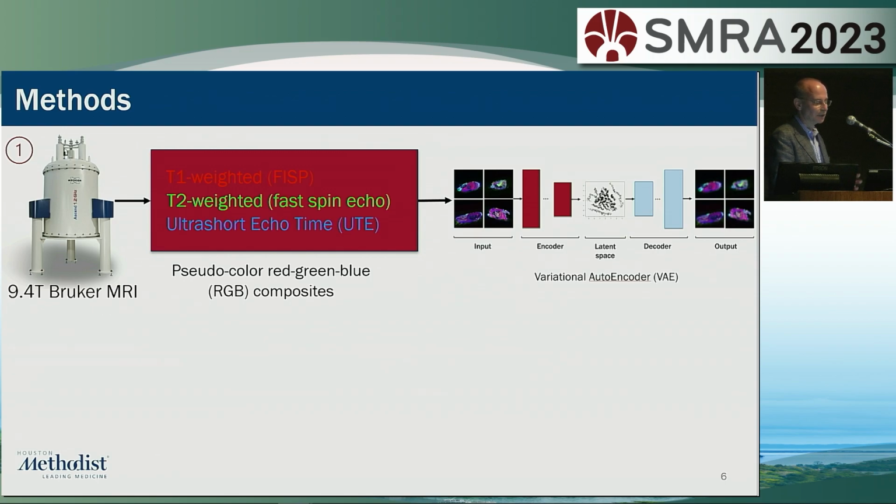So essentially, what you do, you have input, and it's shown there, right? And colored images here, the idea here just being using RGB images, and each component is from an MRI contrast, right? And then we have a 2D convolutional neural network here, and just shown by these two blocks here, no details, right? But you're essentially compressing the information in those images, or extracting, I'd like to say, the information in those images into what we like to think of as a latent space, and in this particular case, actually a two-dimensional latent space. And then once we've done all that, right, we trained the encoder, we got our latent space here.